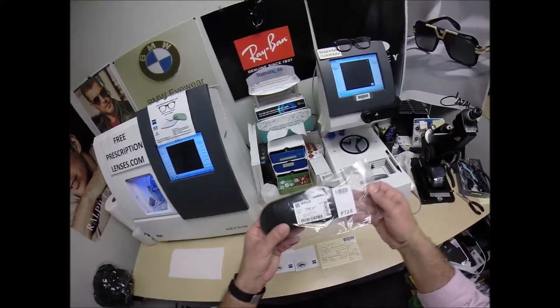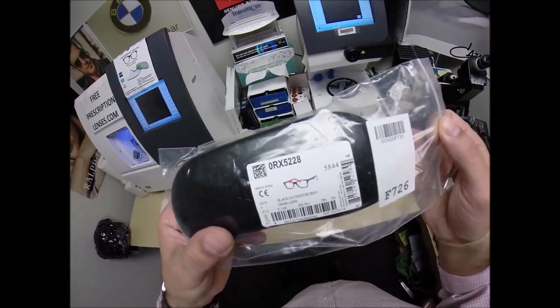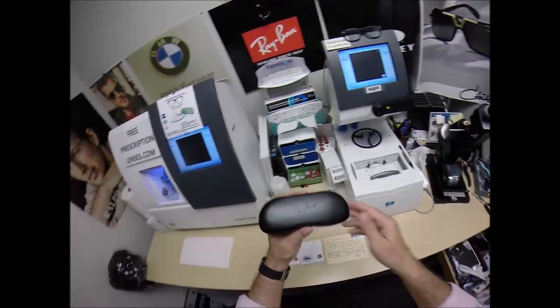When I cut the Ray-Ban 5228 color 2479, which is black on the outside and red on the inside. Let me take everything out of the original packaging as Ray-Ban sends it to me.